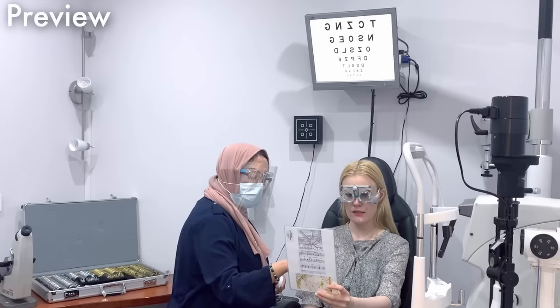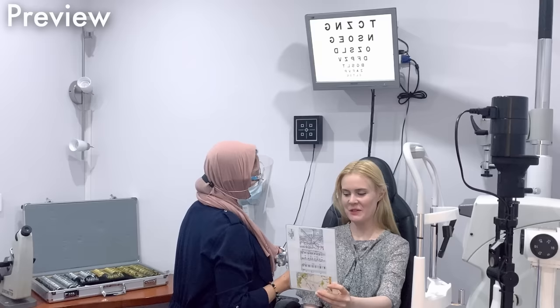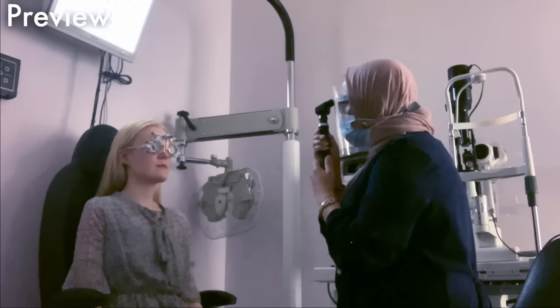All of it. Now keep that position, okay. And I'm going to take this off. And do you see a difference at all? Yeah. Which one do you think looks better? It's much better with the glasses. Yes. So now you know what's going on. Right? Keep looking straight. This just helps me confirm that what I've got for you is correct, so that's good.